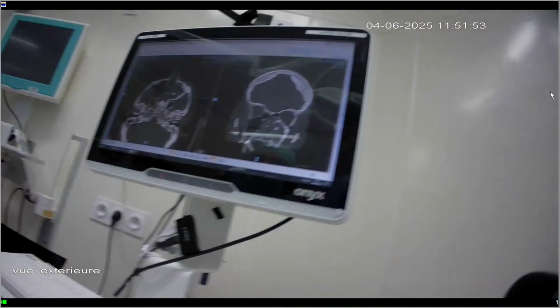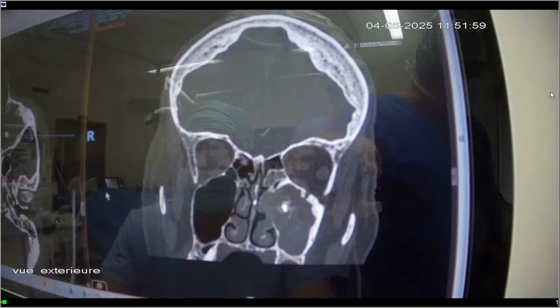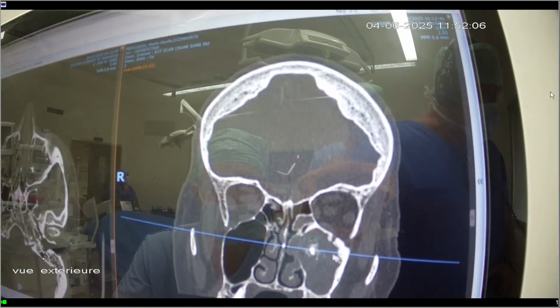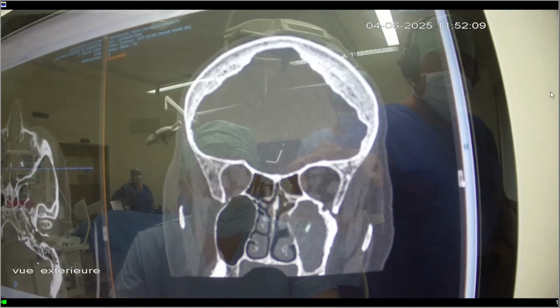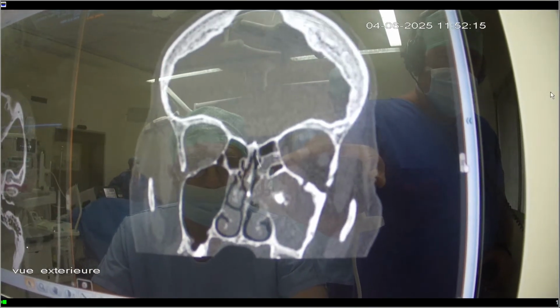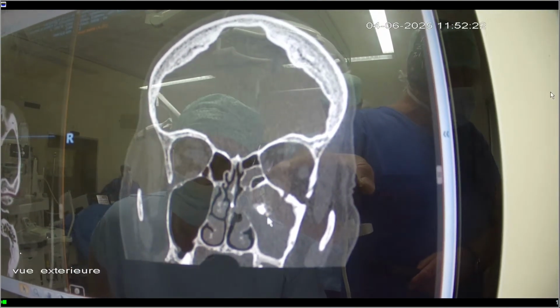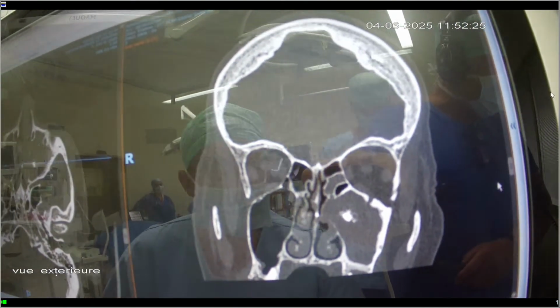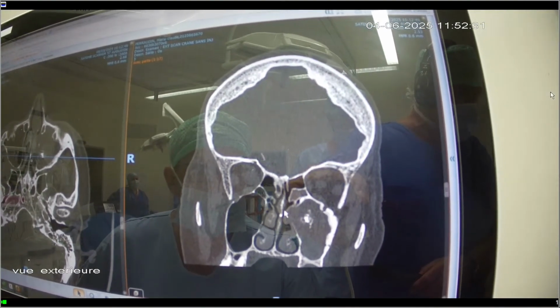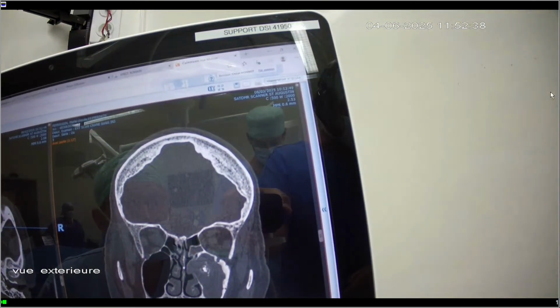This is a 65 years old woman, and she suffered from nasal obstruction and iterative suppuration. As you can see, this is a typical image of fungus ball. Typical because you have the metal hyperdensity, and calcium hyperdensity in the opacity of the maxillary sinus. This fungus ball bulged the middle meatus and tried to exit from the middle meatus.